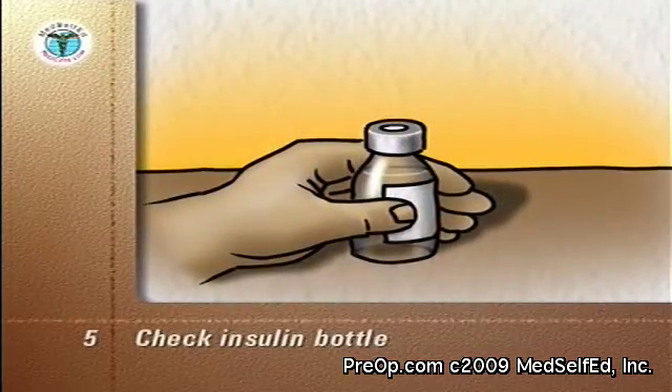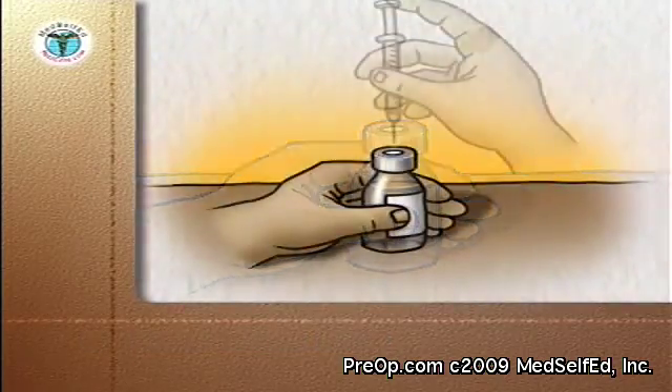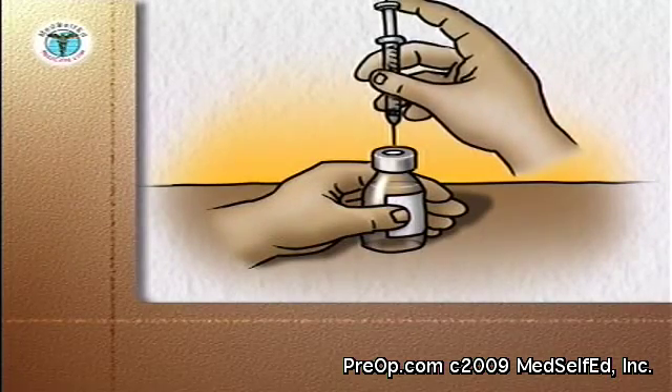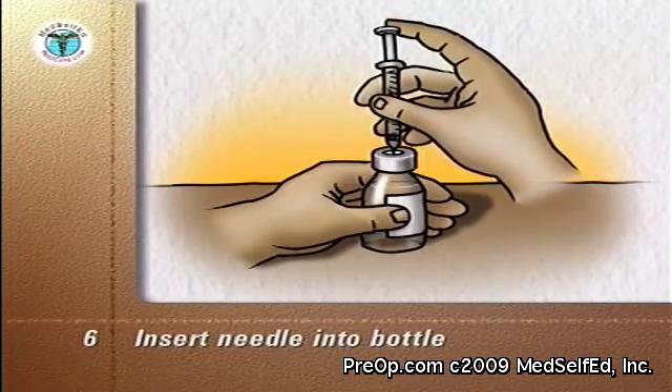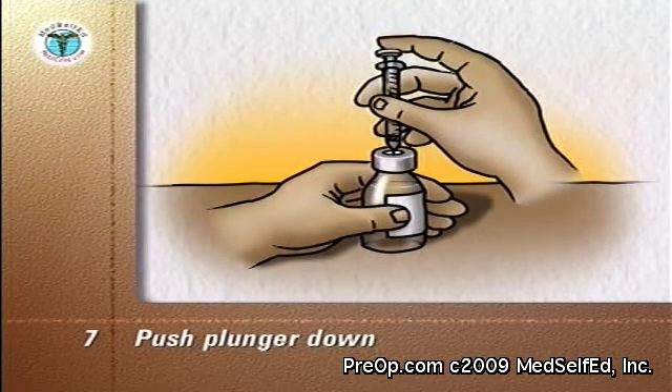Check the insulin bottle to ensure you have the correct type of insulin. With the insulin bottle held firmly on a counter or tabletop, insert the needle through the rubber cap into the bottle. Push the plunger down so that the air goes from the syringe into the bottle.